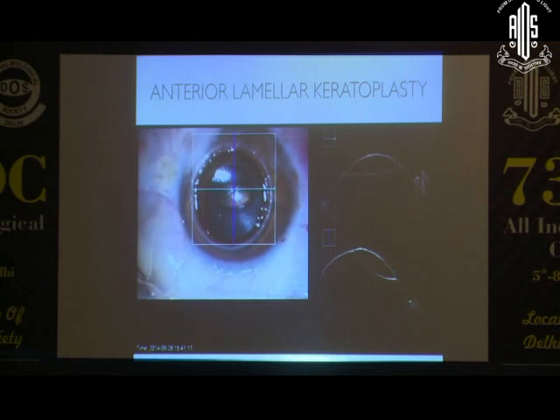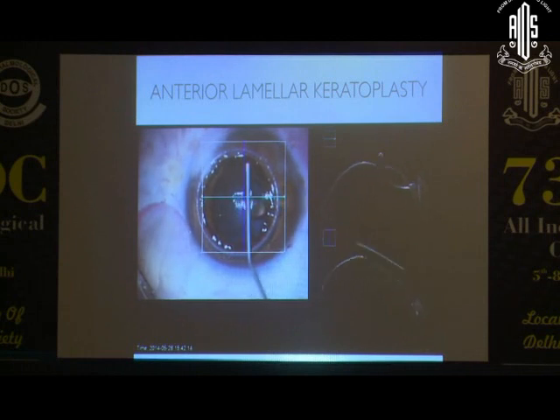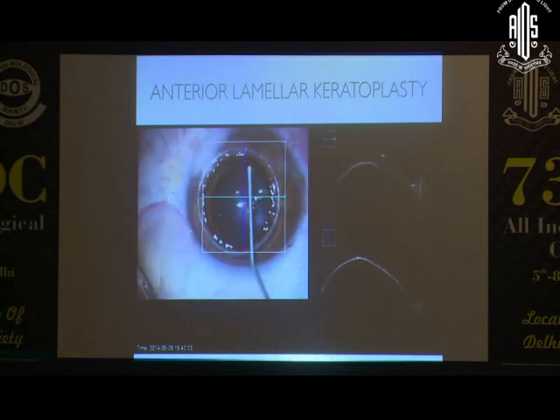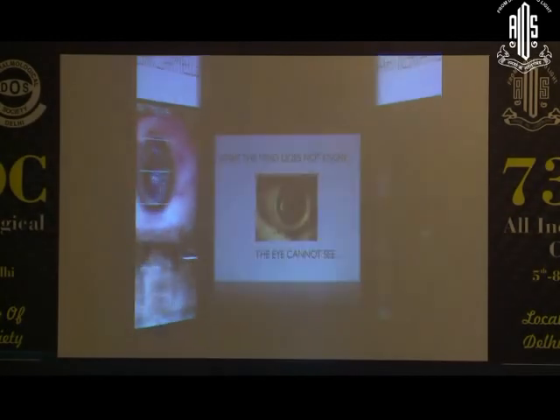So once that was done, we removed the bubble. You can see here the bubble actually being milked out through that small opening, and once the bubble is completely gone, now we are ready to put our sutures. So there's the bubble gone. After that it was pretty much standard, and we did a sutured DALK and completed the surgery without any problem.